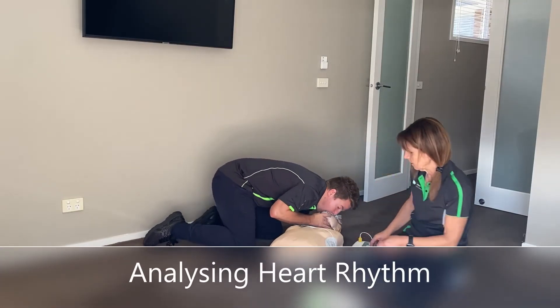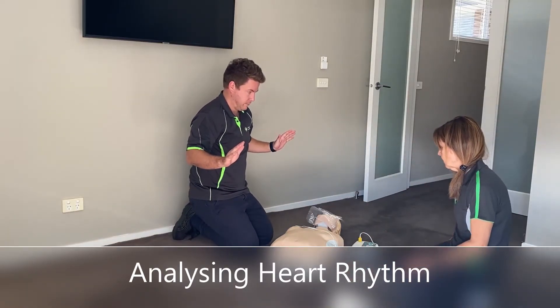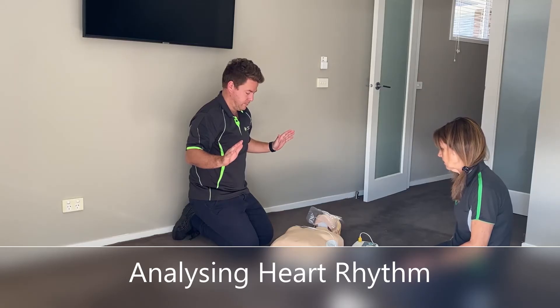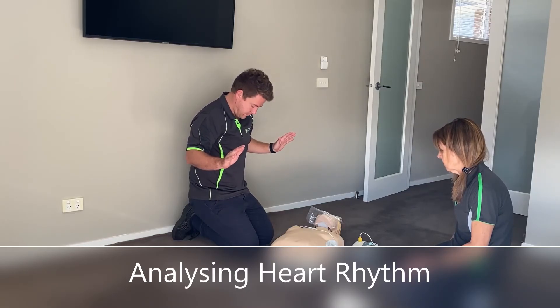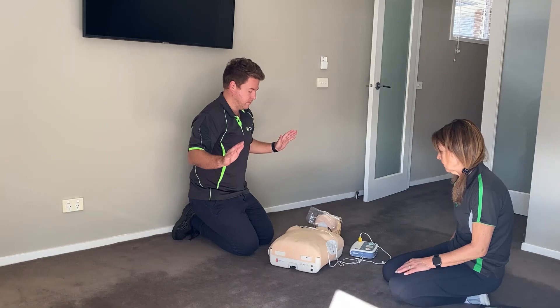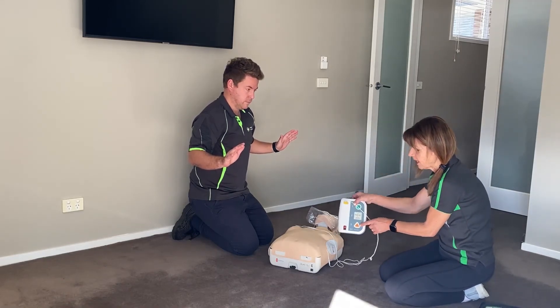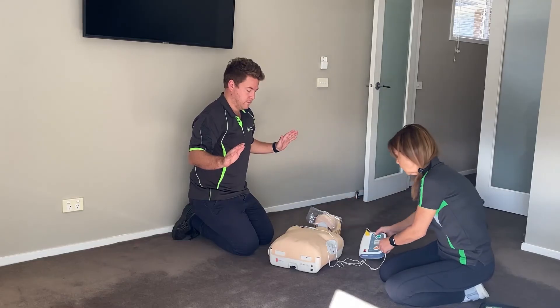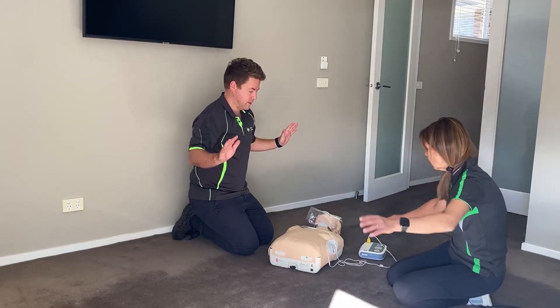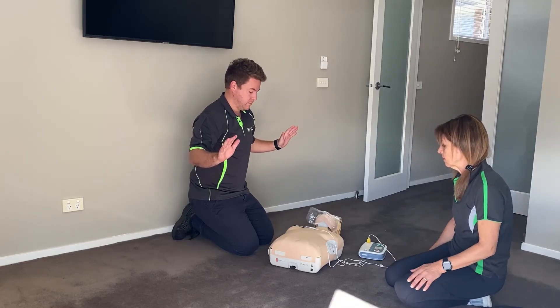Do not touch the patient — analysing heart rhythm. Clear. Analysing heart rhythm. Press the orange button once it flashes, and make sure everyone is clear. All clear. Shock delivered.